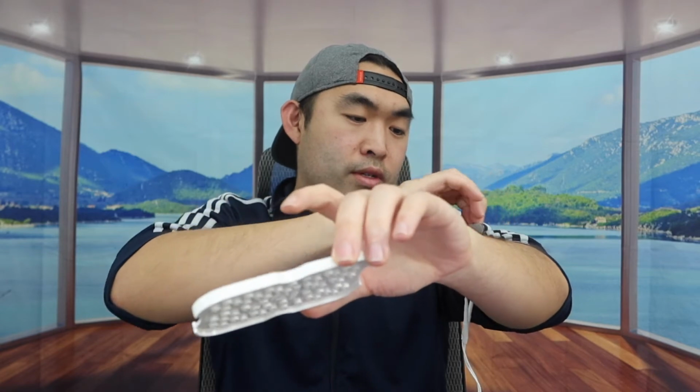So when you're done using it, you basically want to turn it off. And once you turn it off, you want to peel this part out and just stick it onto this part here. So just like this. Same thing for the other one as well. So once you put it on here, then you're all set and all done. If you want to use it somewhere else, like maybe on your leg or your shoulder or your back, you can definitely stick this on there as well.